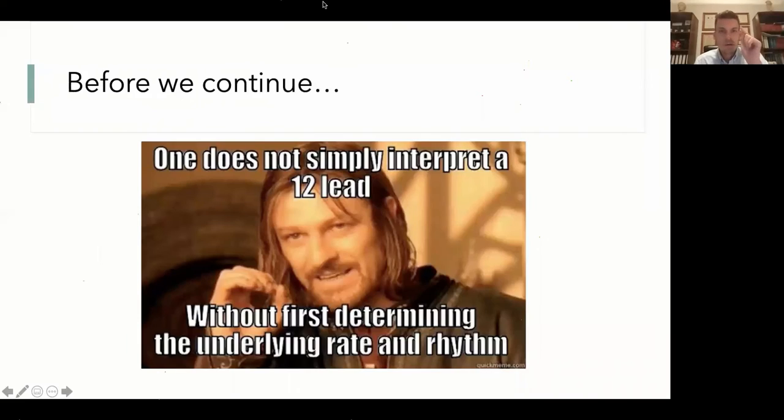Good. Now, keep this in mind. You will never talk about an ECG without first determining the underlying rate and the rhythm. So the first 3 steps are pivotal in order to understand how an ECG will be presented to your teacher, to your professor, or to anyone in your clinical practice. And I hope that everything we said right now makes sense because there's nothing more you need. This is enough to explain the basic things that occur during an ECG.